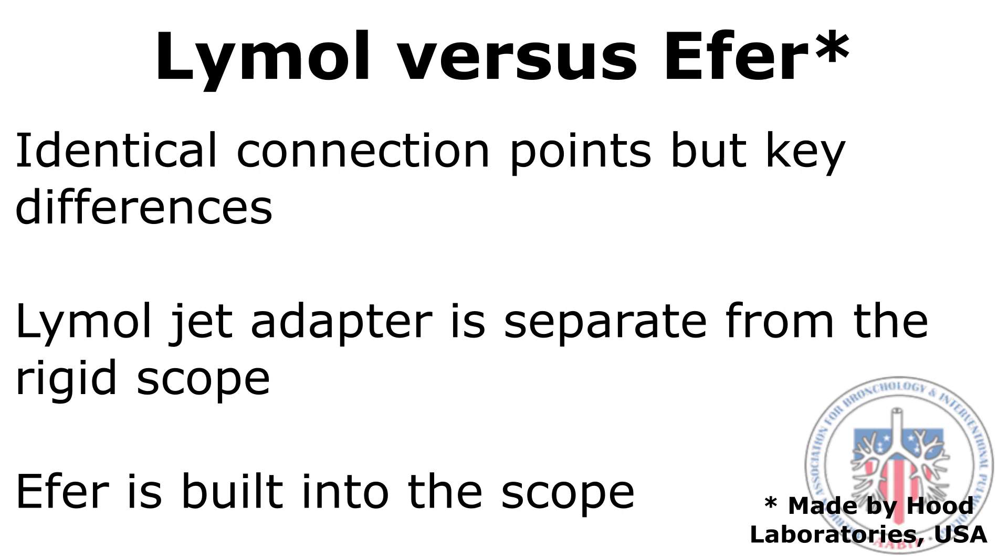First, the Lymol jet adapter is separate from the scope and must be connected to the scope. However, the Efer jet adapter is built into the rigid scope.